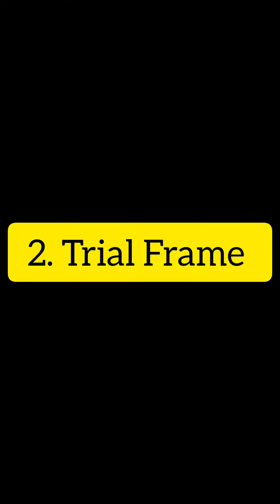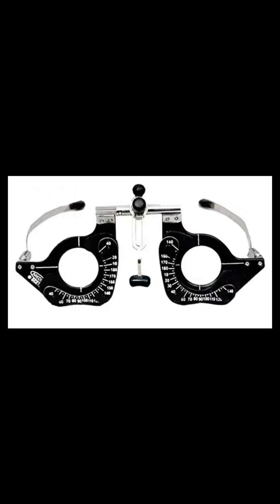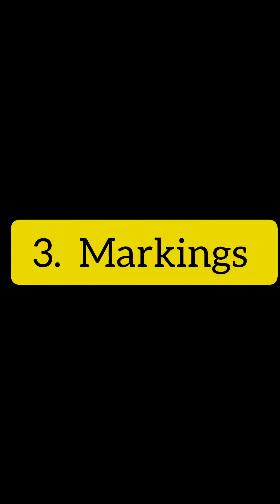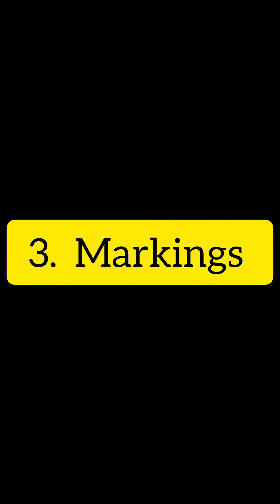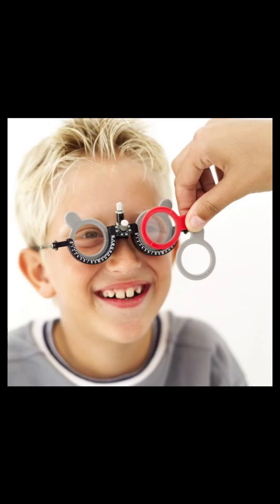Number two, the trial frame. This is an adjustable frame that holds the lenses in place during the refraction test. Number three, markings. Each lens is clearly marked with its power, making it easy for the optometrist to identify and select the appropriate lens during the eye examination.